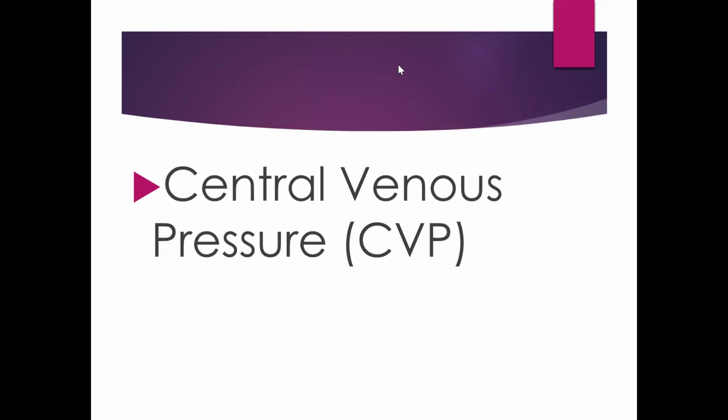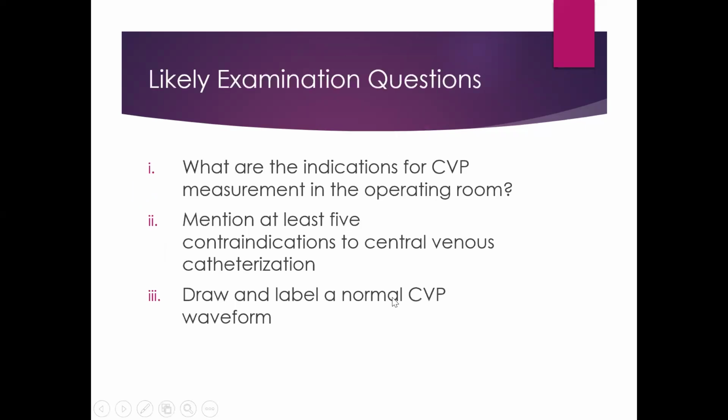We'll think about that. So central venous pressure, this is important as a means of monitoring, both in the ICU and the OR.